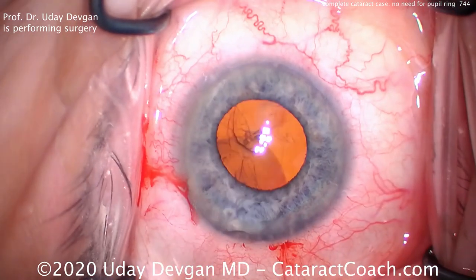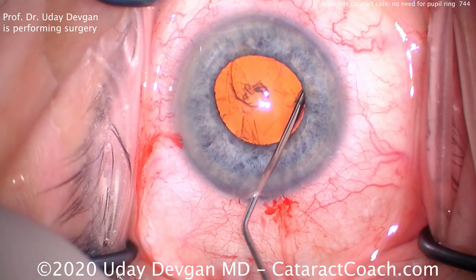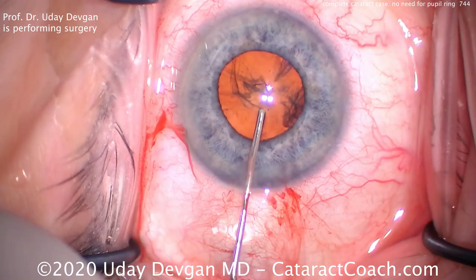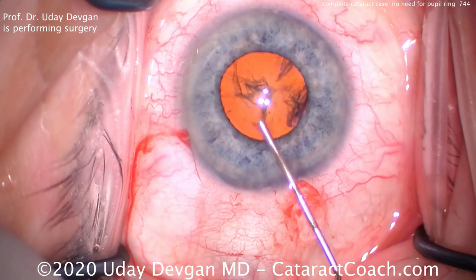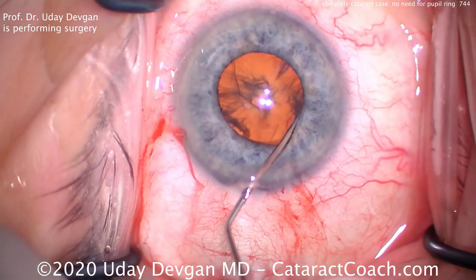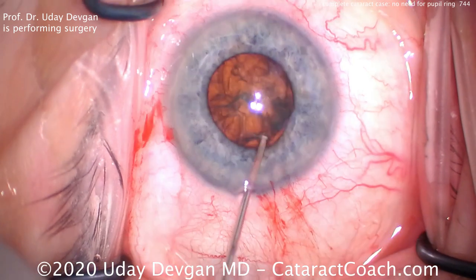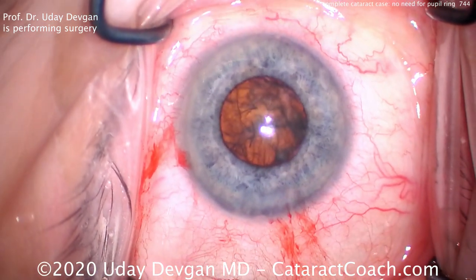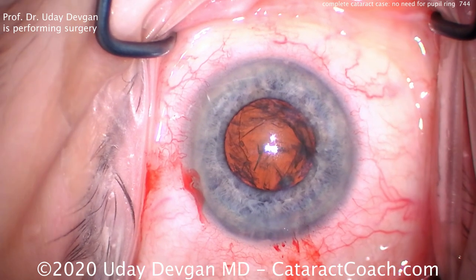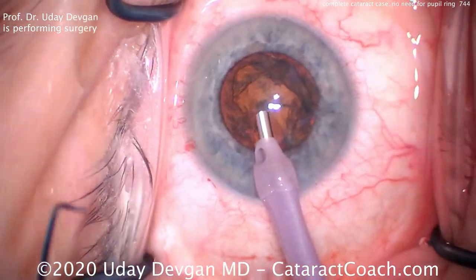I've shown you videos in the past where we prolapse the nucleus partially out of the capsular bag. In this case, we're gonna leave it in the capsular bag. The reason is this patient's hyperopic, putting in a 26 diopter IOL for an outcome of about plano. So a little bit of hydrodissection, tapping the nucleus. You can see the pupil's already coming down — because we've lost some of the viscoelastic that was giving us viscomidriasis. Slow and steady, getting good fluid waves, and the AC is a little on the shallower side. There it is — now we've got about a four, maybe four and a half millimeter pupil opening. A little more viscoelastic, and we're gonna chop this nucleus in the capsular bag. The anterior chamber is relatively shallow, only 2.2 millimeters, so we don't want to prolapse the nucleus.